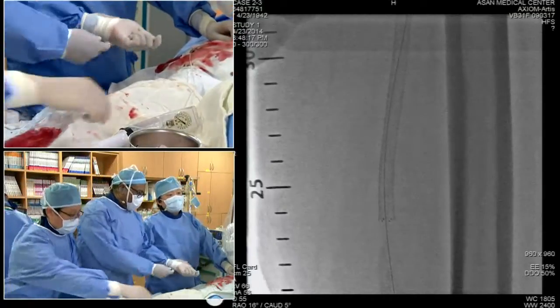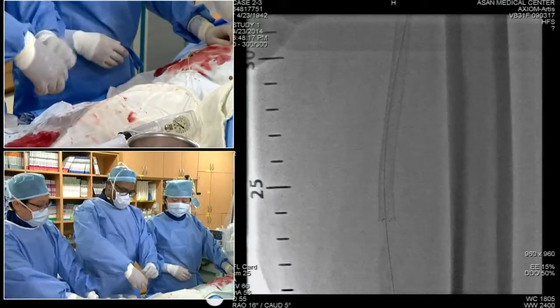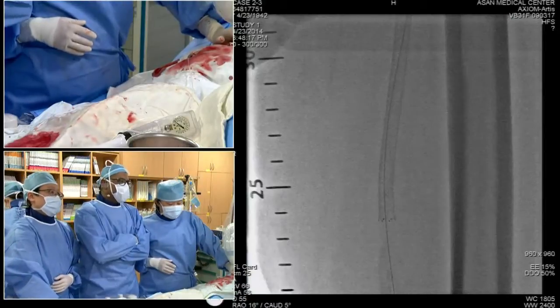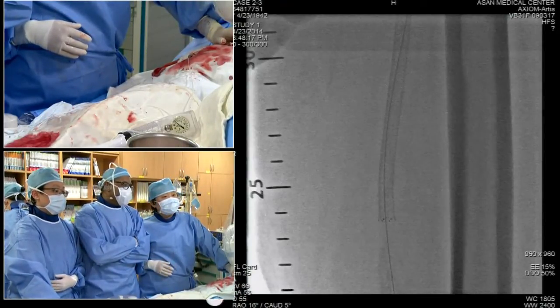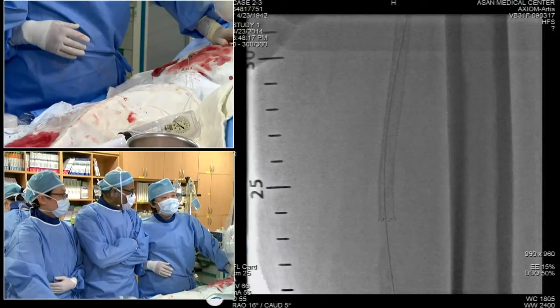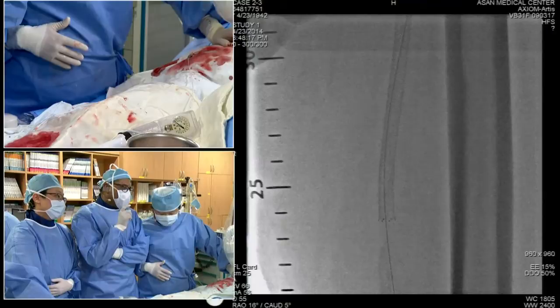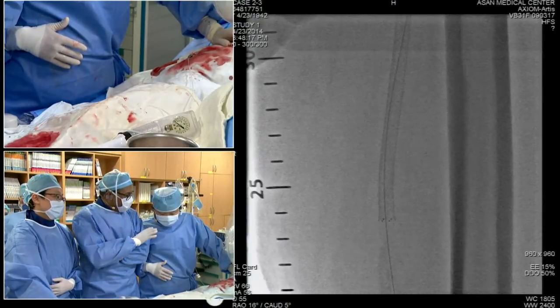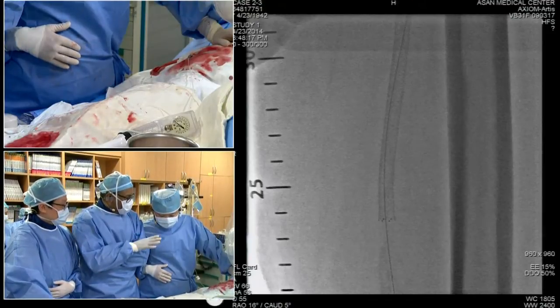So we're still working with a 14 wire here, which now we decide what we're going to do and what our options are. Balloon angioplasty, obviously, within the stented segment, within the native segment. Is it your practice that you would stent proximal and distal to that stent? Now, what do you do with total occlusion within a previously deployed stent? Do you do just angioplasty or stent?